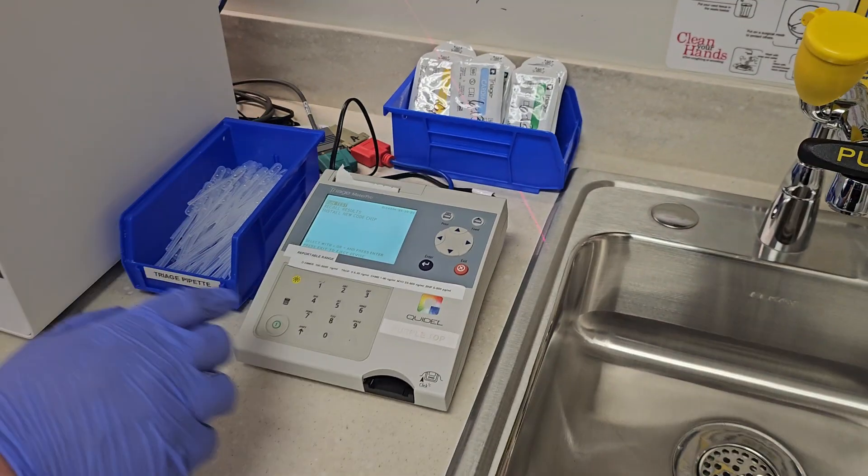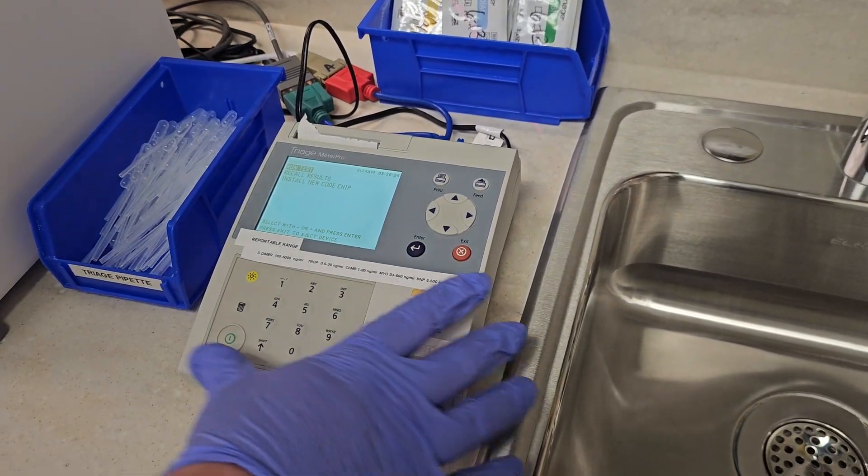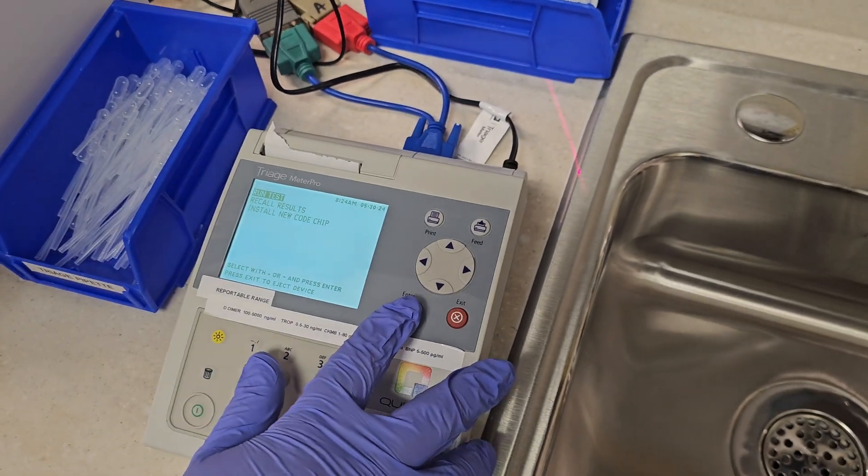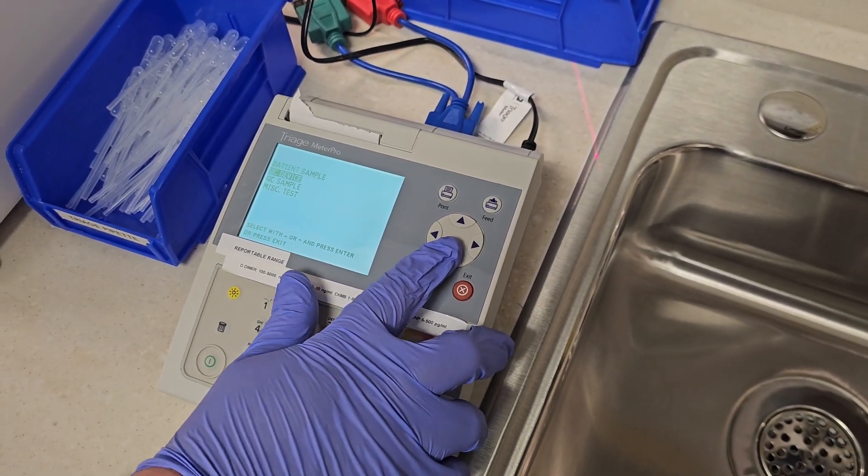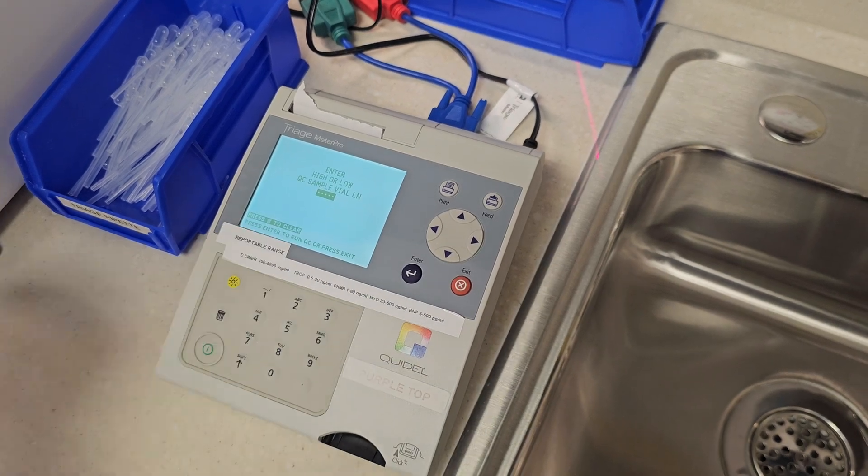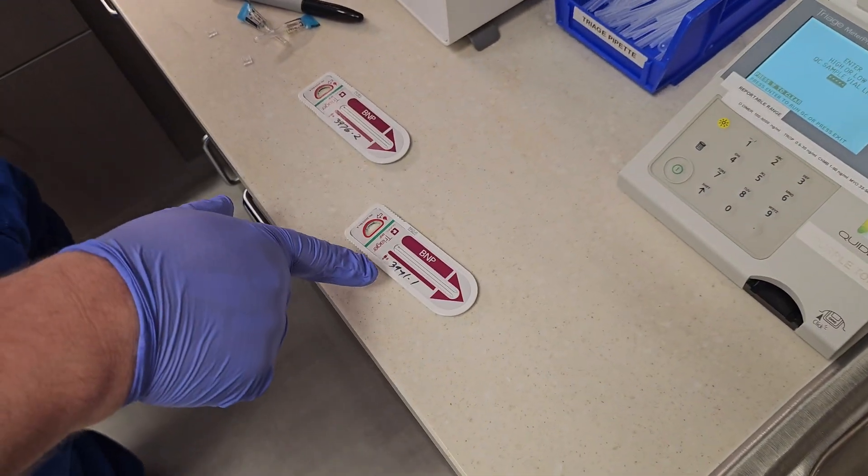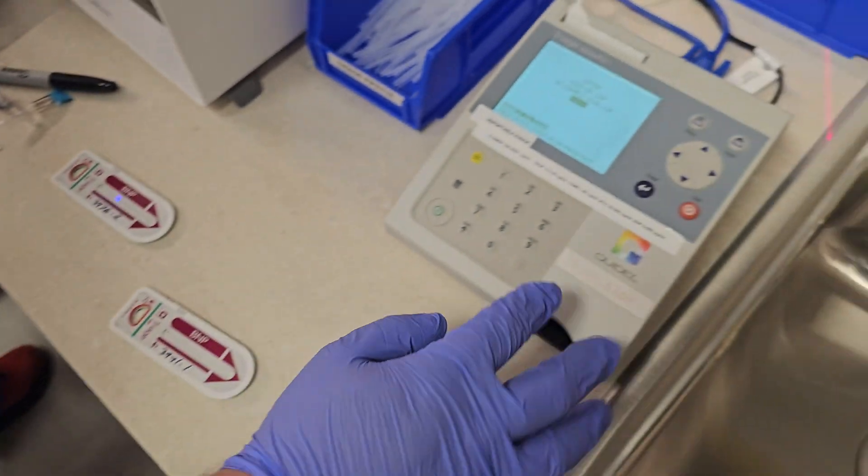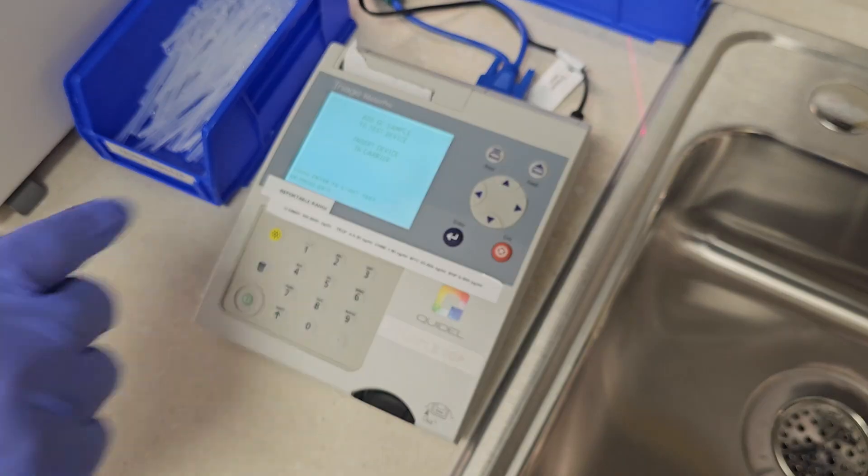We'll come to the analyzer here. We're going to go to run test, hit enter. We're going to go down to QC sample, hit enter. It's going to ask me for that number. There is a letter that comes before that number, just disregard the letter and put in the number 3971. That's my level one.